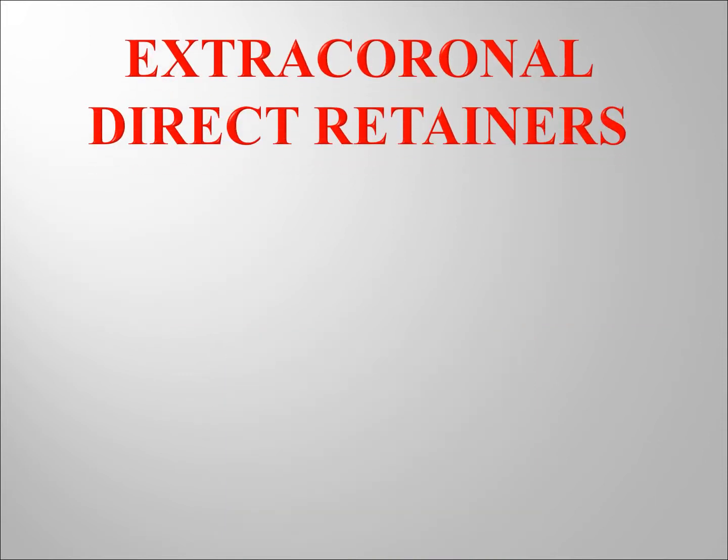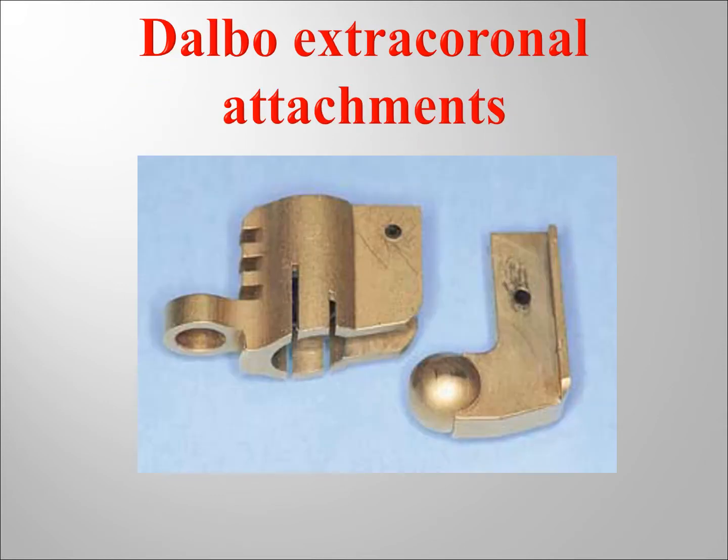Now, extracoronal direct retainers. The direct retainer, whether it is an attachment or a clasp assembly, is contained outside the contours of the teeth, the normal contours of the teeth. This is an example of an extracoronal precision attachment. It's called Dalbo. There are so many different types. I don't want to go through them right now.